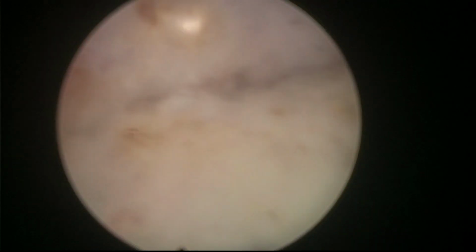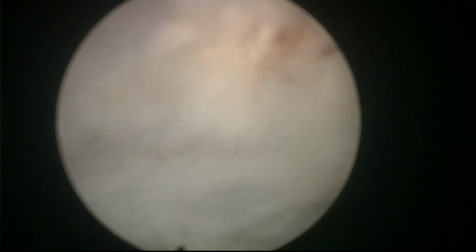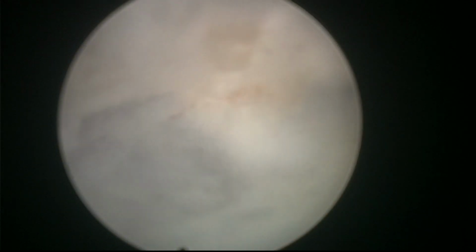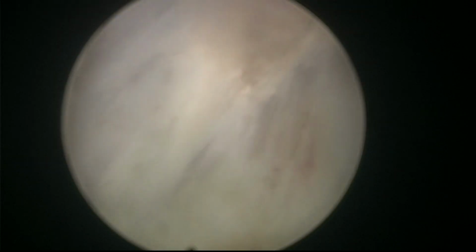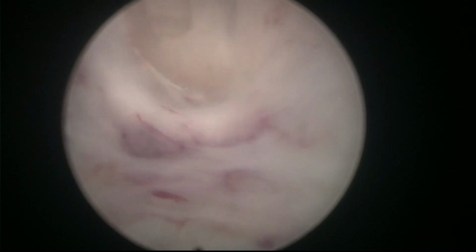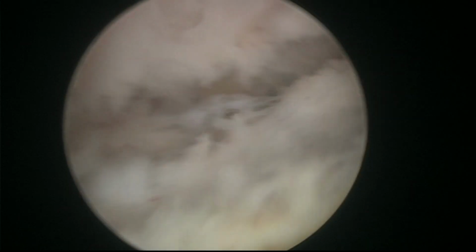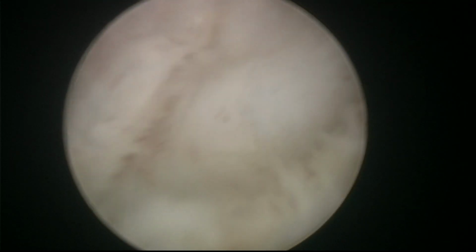So we'll have to review here at the end to see. You see, it looks good to me up there, but we have to unify the line of dissection anteriorly. So I'm going to work a little bit on it. Sometimes the anterior plane needs a little bit of work, which means going back and forth like this, you see, to make sure that the anterior line is connecting properly to the lateral and the lateral is connecting properly to the posterior, and we are following an apparently nice line here.